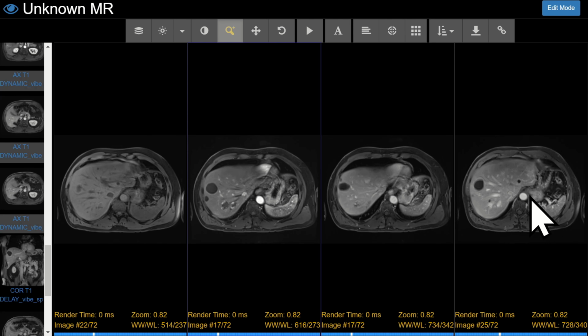Of course, after looking at the liver, we're going to look at the structures in the rest of the abdomen, which is all covered in the body MRI intro video with the link to that approach on the screen. And so we'll cover the biliary system, pancreas, other solid organs, etc. in more detail in future videos.